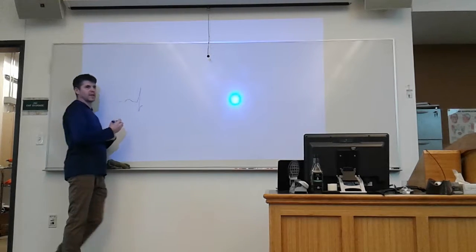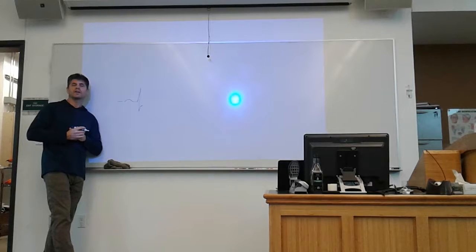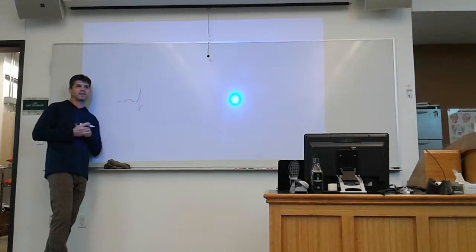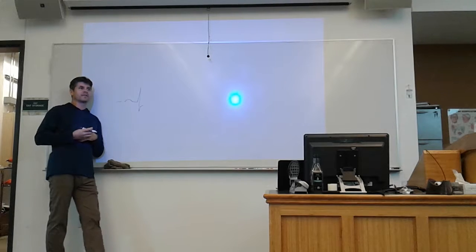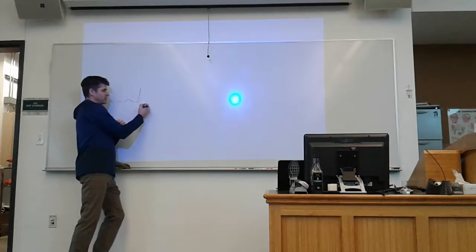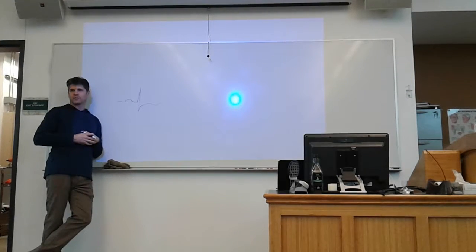And when it comes to ischemia, we start to see that by seeing a depression right here. A depression because things are coming back to resting membrane potential, but it's happening slowly because not all the cells are able to repolarize as quickly as the other cells, because some of them are fine and are repolarizing normally and some of them are not. Does that make sense? So we see one of a couple things. Either we see an ST depression or a flipped T wave, or a combination of both.